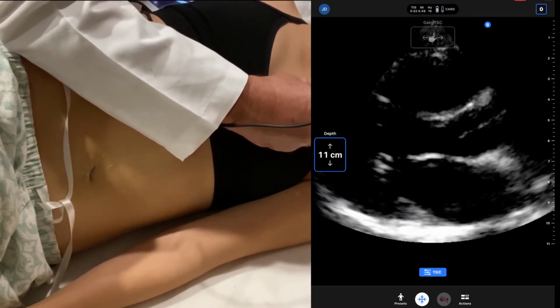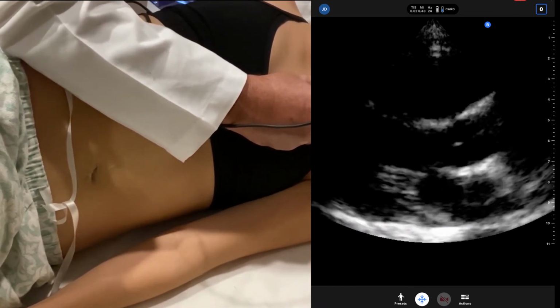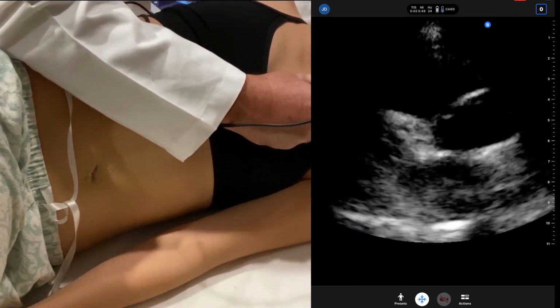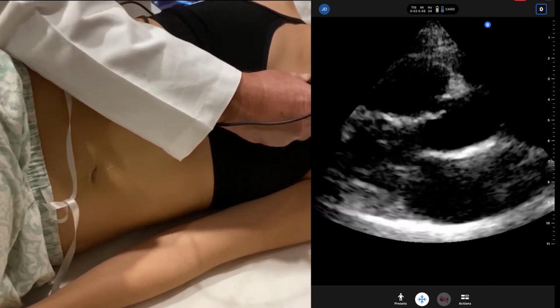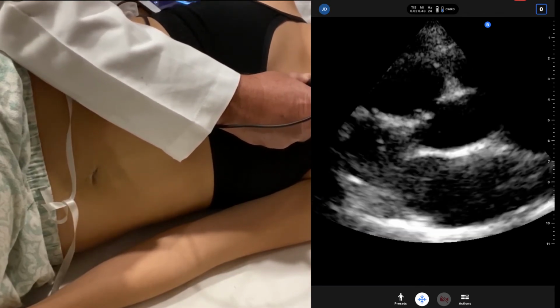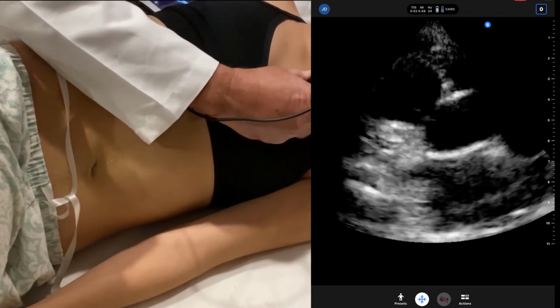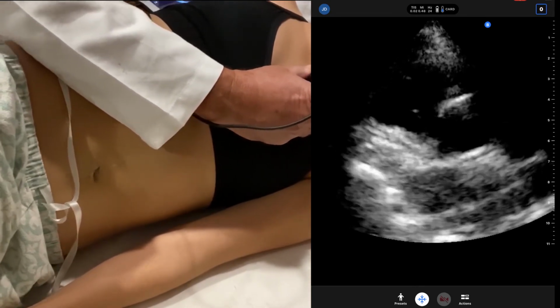Clean this up a bit. And there's our aortic root. We don't see any kind of dilatation around the root itself. You can angle out. You can just go that extra mile and take a look at the aortic root in the parasternal long axis view. And that is how we do abdominal aortic aneurysm evaluation.